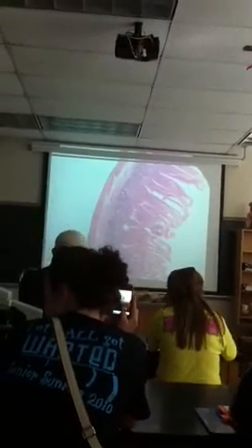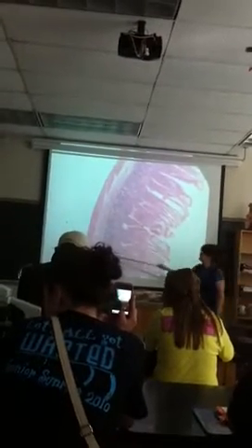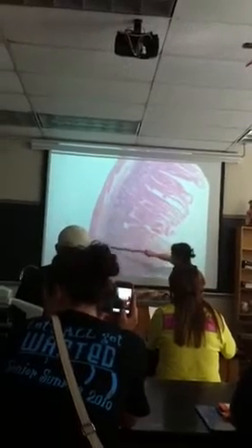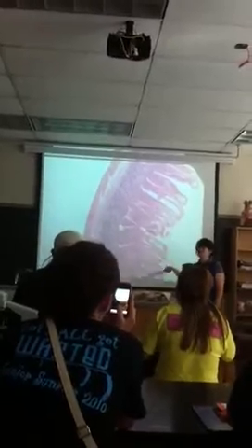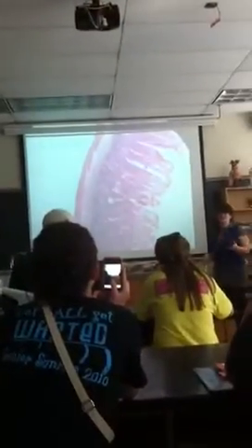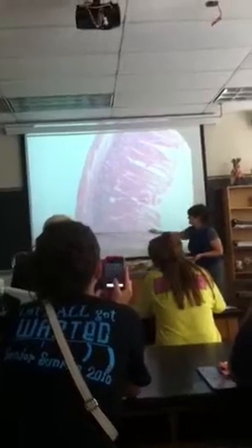And this right here is the jejunum. So we still have the mucosal layer, the submucosa, the muscularis externa, and this, it's really thin here, but the dark pink of the serosal layer. But what do you notice about this submucosa? Do you see anything distinctive in it? Not really, right? You can't really see any sort of glands or other types of mixed tissues. It's just sort of this layer that's really nondescript.